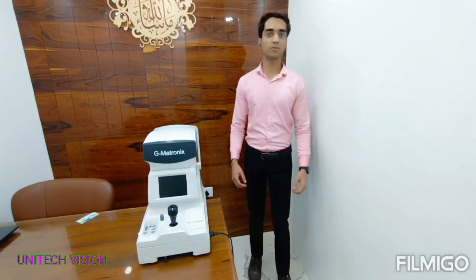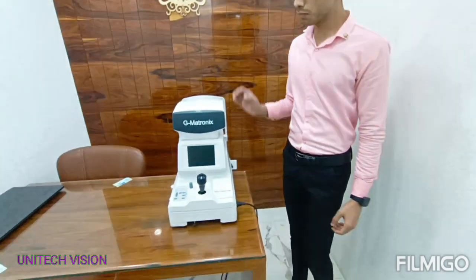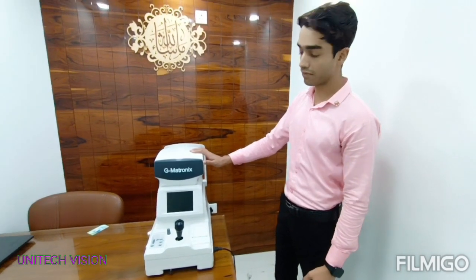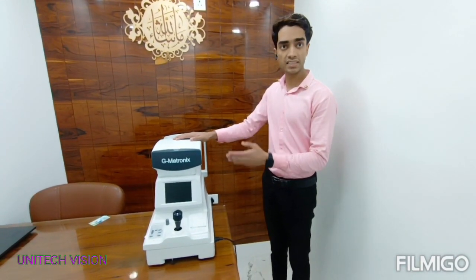Hello friends, I hope you are fine and well. Presenting you the most popular autoref of G-Matronix R30 Plus with 95% accuracy. This autoref is very easy to operate.